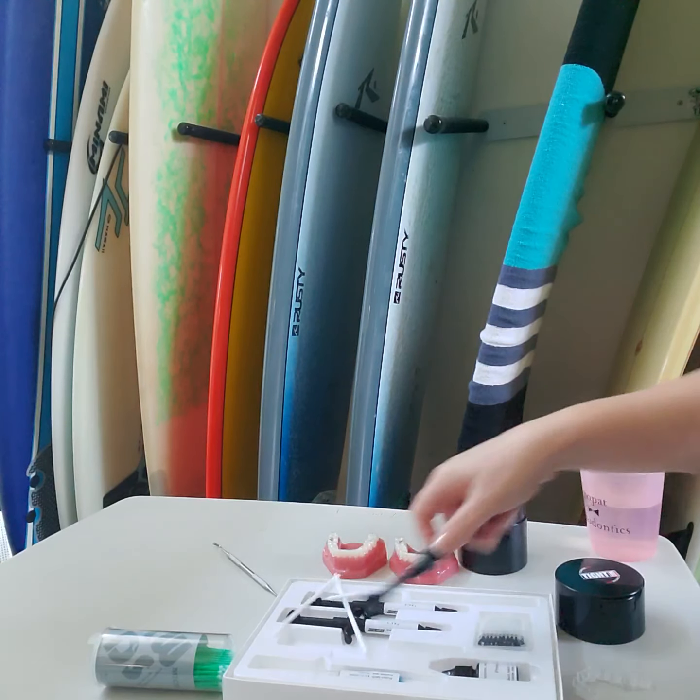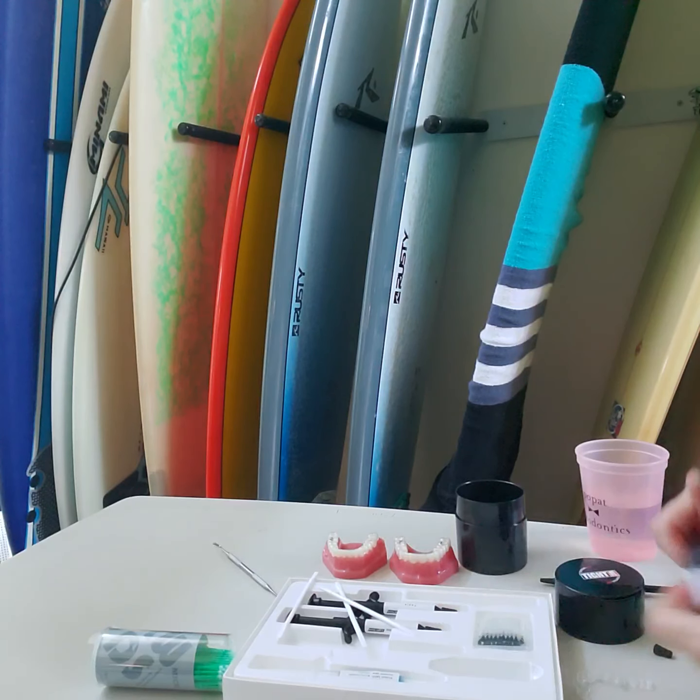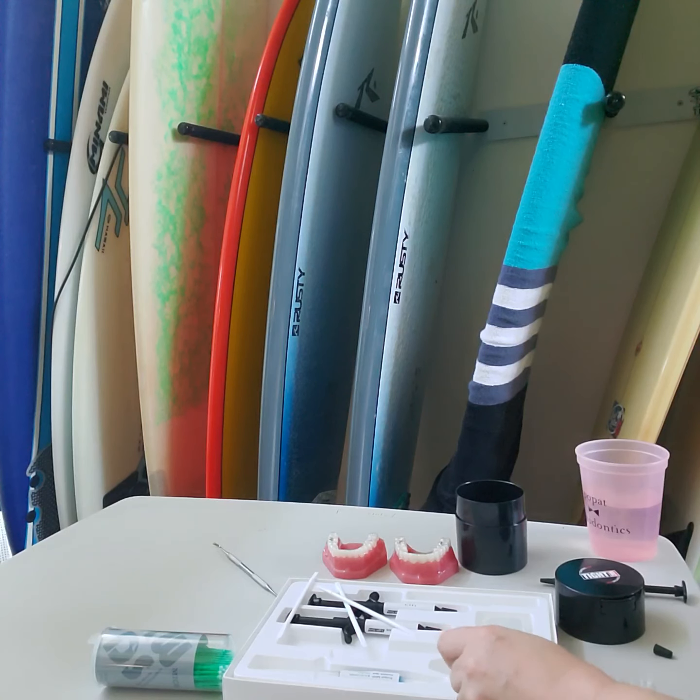You're going to go ahead, get your pad, express a little bit. You can see, obviously, this is not an actual office today, so we're kind of mimicking what we're actually going to do. But I like to use micro brushes to pack it down.